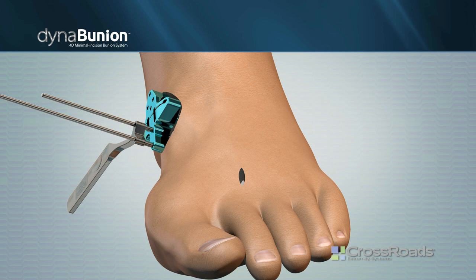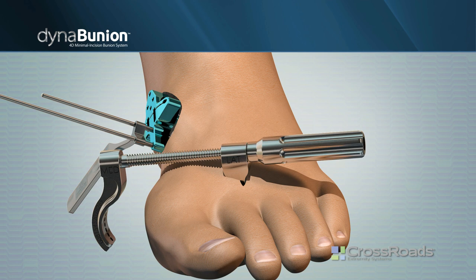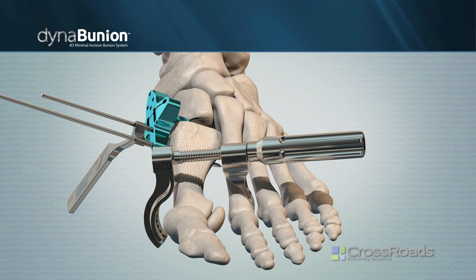Place the lateral hook of the reducer around the neck of the second metatarsal between the second and third metatarsal. Place the medial hook over the skin onto the head of the first metatarsal. While holding the reducer in place, tighten the reducer knob clockwise until it is snug, but do not close down all of the intermetatarsal angle.